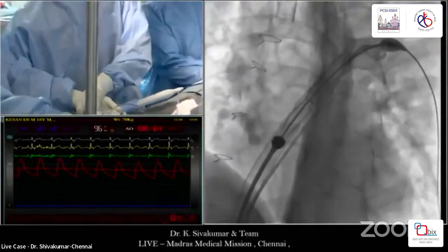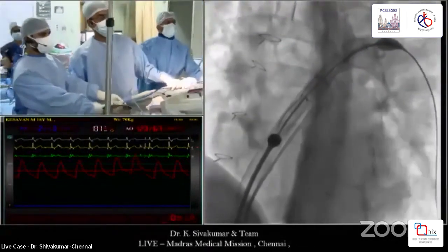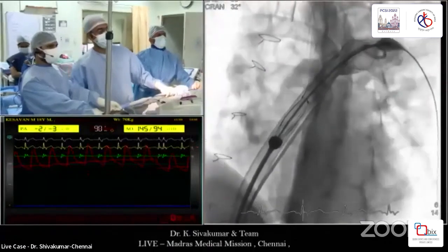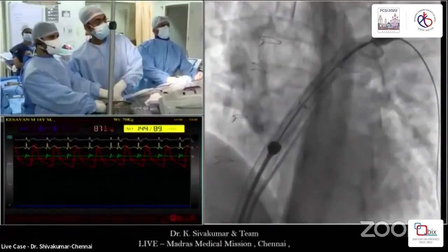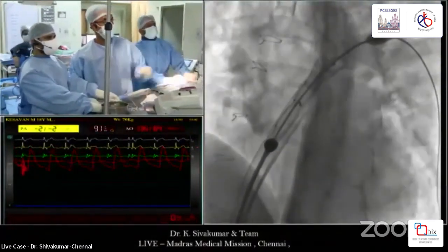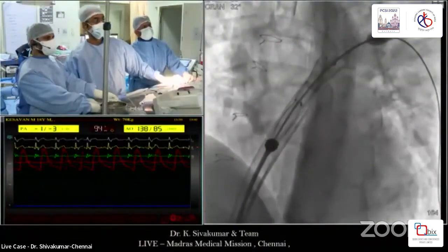A little bit I have come out. Can we have one more picture? Shiva, Shaq has a comment to make. At this point, I would also pull the pigtail back, because your distal flare is coming back now, very slowly. Okay, one more angiogram.